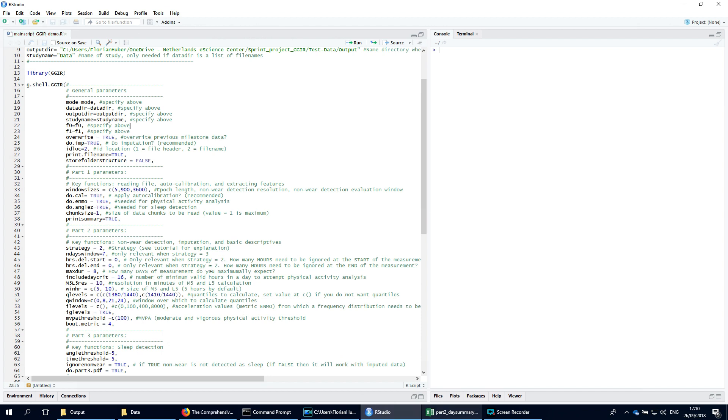GGIR is structured in 5 parts. Part 1 loads the raw data and aggregates them to epoch level summary matrix. Here, with argument window sizes, you can specify the length of an epoch in seconds, but also the length of the time windows used for the non-wear detection.